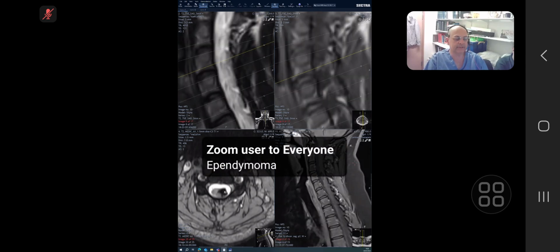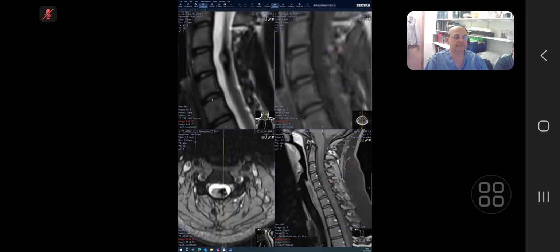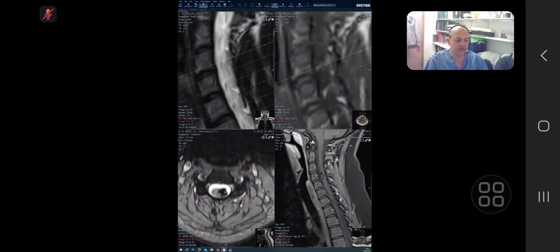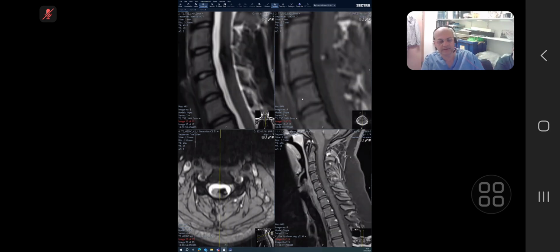Given hemosiderin deposition and central non-dark T2 signal, this has features of a cavernous venous malformation. The reason is that the hemosiderin rim is complete and there is a central mulberry of bleed that cavernomas usually have.